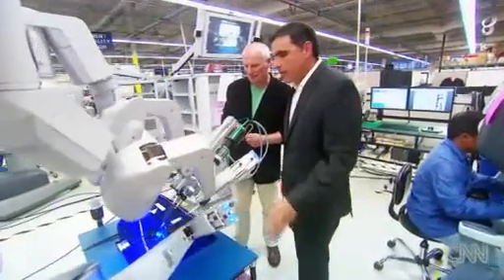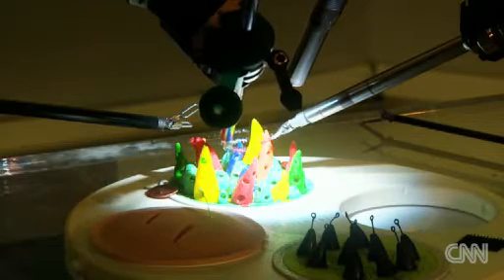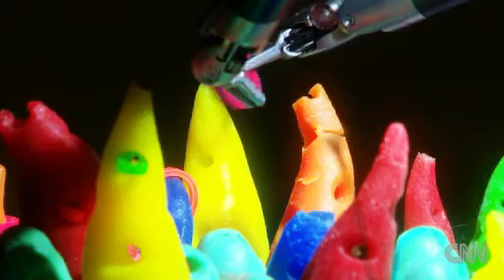I was nervous, and there were 10 engineers in the room. I remember a few people would joke about my gloves being filled with sweat. They were just wet because we were all nervous. Anxiety soon turned to optimism. The benefits to the patient were clear. It's really the benefits of minimally invasive surgery. So the patient will have less pain, less time to recover, generally less blood loss depending on the operation.